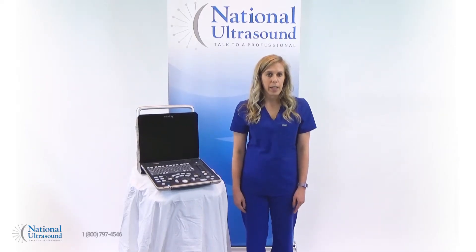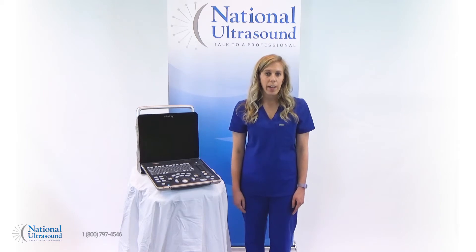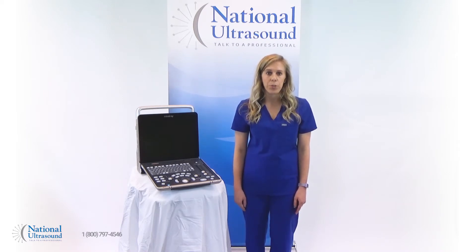My name is Chelsea and I'm a registered cardiovascular and general sonographer with seven years of experience. Today I'm reviewing the new Mindray Z60 color portable ultrasound machine.